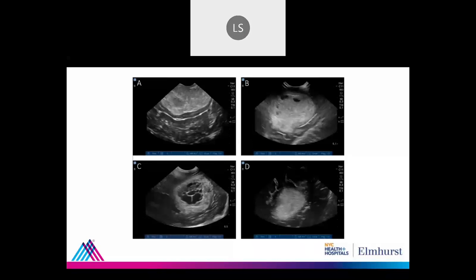Also pretty well circumscribed, but there are those areas that are hypoechoic. Are those vessels that are penetrating through? Those are cysts. Or, well, they are actually necrosis areas. Okay, then that would probably say it's some kind of glioma or GBM, if it's heterogeneous. Overall, well circumscribed and intraparenchymal, with heterogeneous sort of size.